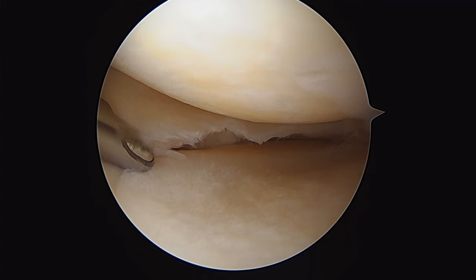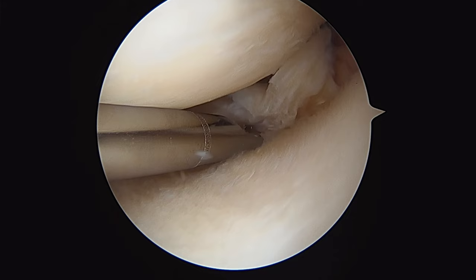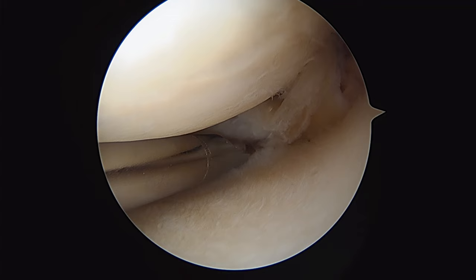This is our 3-5 shaver coming into the medial compartment of the knee. We use our suction and just gently hover over this torn bit of meniscus, then slowly slide it around the back trying to avoid the cartilage, and just trim out this little bit of torn meniscus tissue.